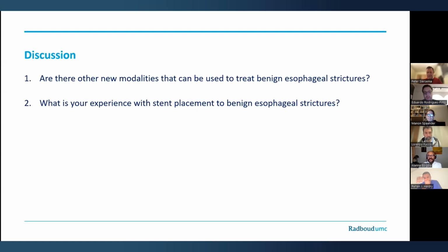No, this was the first case, and of course we have experience with direct endoscopic radial incision or direct stricturotomy, but because of the complicated nature of this stricture, it was also angulated, and the radial stricturotomy would not have been possible because at the opposite side you could already see the tissue of the gastric pull-up side. So the depth of the incision would have been very difficult to judge. And because of the tunnel, which was placed exactly adjacent to the stricture, it was very easy to follow the line of the tunnel for stricture dissection.